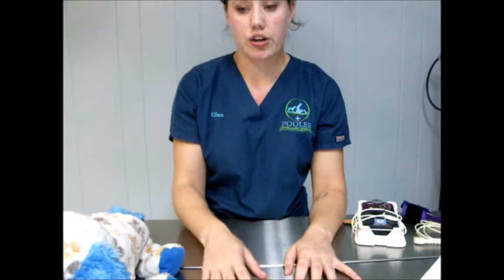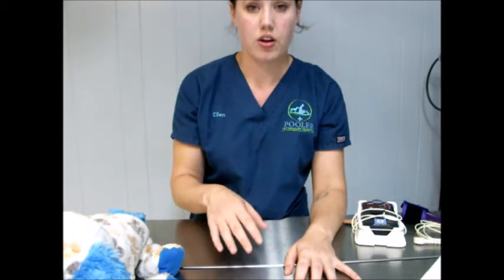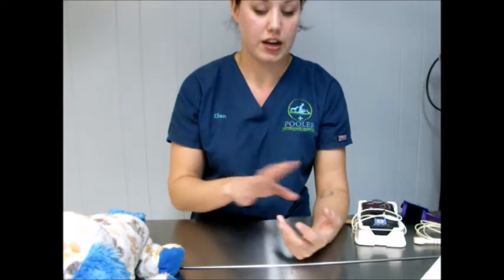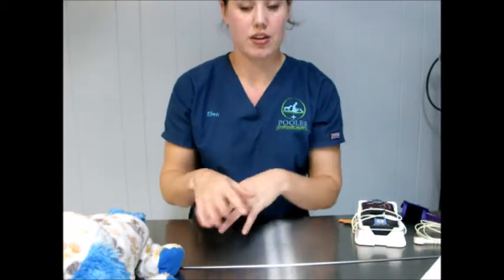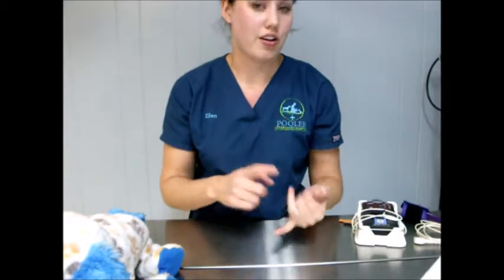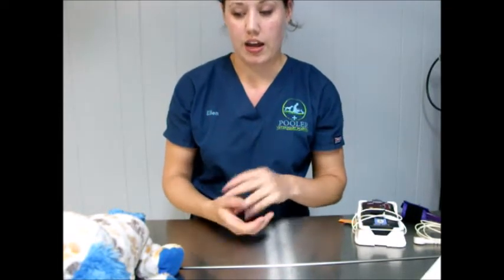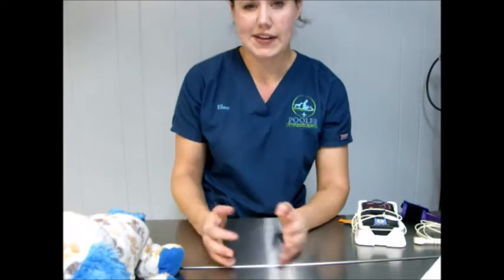So we want to make sure that, when we put a patient under anesthesia, that we're monitoring them correctly, heart rate, respiratory rate, etc., that we aren't affecting their body systems so that they will wake up okay, but also that they're not going to feel it, not going to remember the surgery, and wake up smoothly like nothing's happened to them. So we have a very delicate balance that we have to keep together.